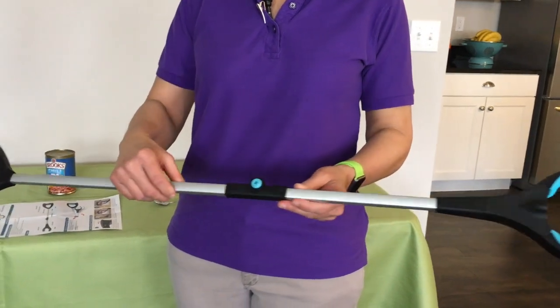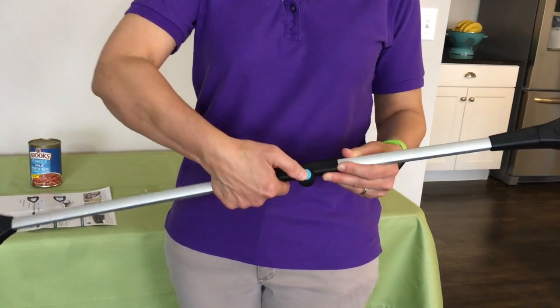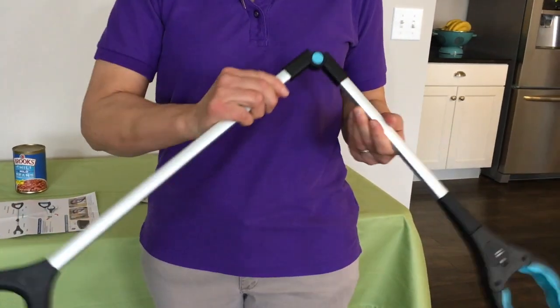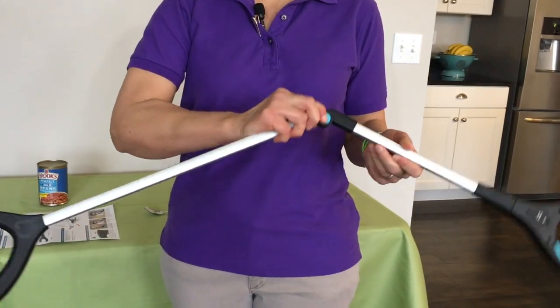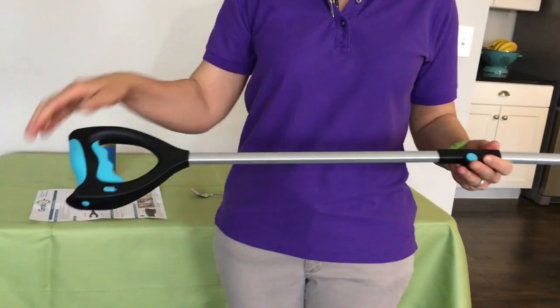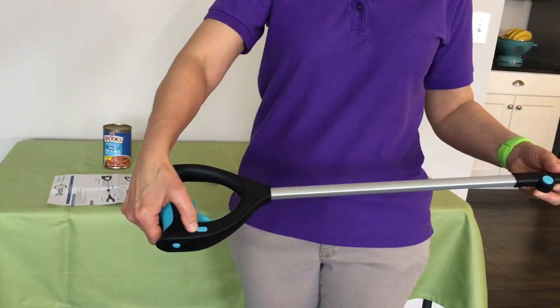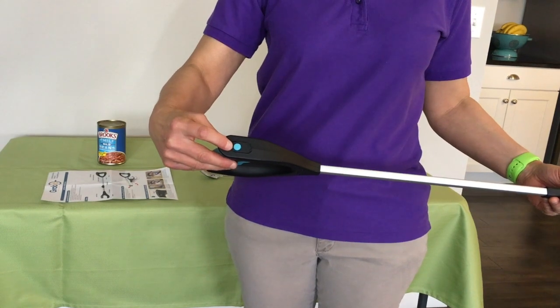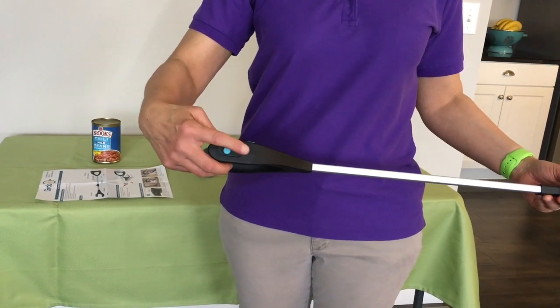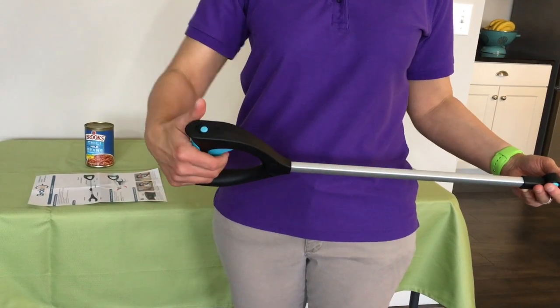As we move down the reacher, right here in the middle, there's a push button that allows you to push and fold this up so you can actually store this in a drawer — that's a nice feature. On the other end of this reacher, here's the on and off button for your flashlight. There's also another button here at the top that slides forward and back to change the reacher from a standard reacher to a ratcheting reacher.